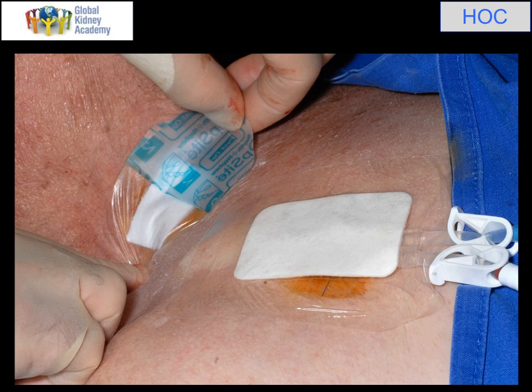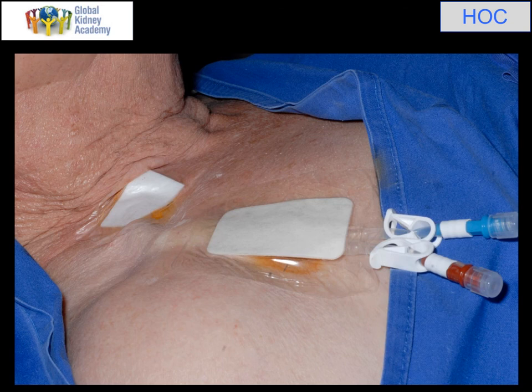These catheters work very well. They can stay in for months, even years. They do get complications — they can block with thrombus, and they can also get covered by what's called a fibrin sheath, which is like a film of fibrin that can block the holes at the end of the catheter and stop it functioning, and that has to be sorted out radiologically. And that is the end of this talk. I hope you found it helpful.